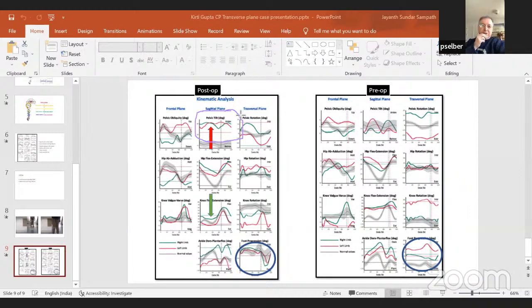So when we start looking into the sagittal spinal pelvic alignment parameters, you see that this is directly correlated with quality of life in adults. And there's a lot of papers that talk about that. So anyway, I think we have to use this case, and lots of people have these cases. They don't feel bad about it. Just to teach the younger generation to say we need to do better than this. We got her better, the knee is better, the rotation is better, but the pelvis is really, really worse.